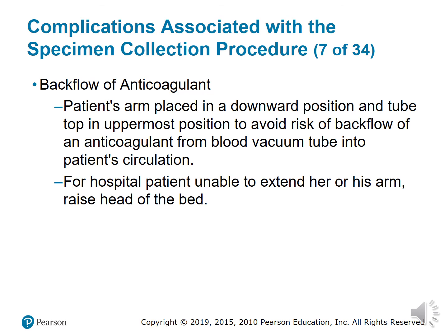Like in the lab, the yellow top tube, you see it has that anticoagulant substance in there. And if held at the wrong angle, because the tube is in the hub and the hub is being pierced by the straight needle or the double-sided needle, that AC can go up the back end of the needle and flow into the body. That's essentially what this is saying. So you want to make sure that you hold it down. Again, the steps. This is why we practice the steps.